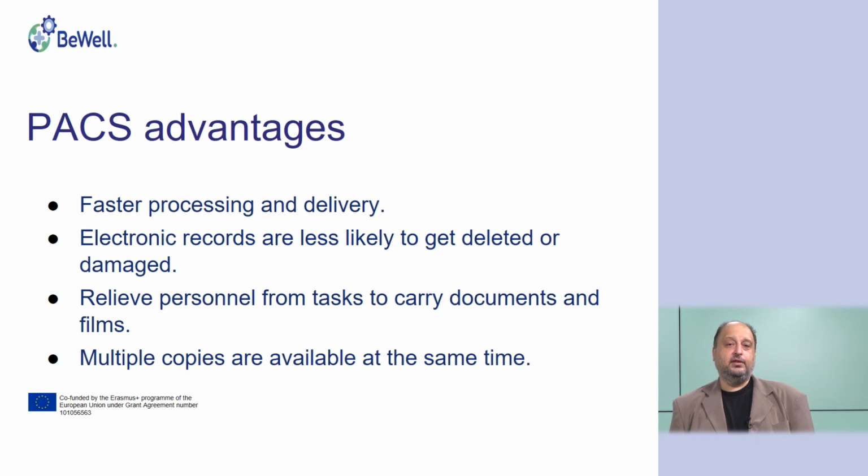Faster processing and delivery, no need for someone to take the film and bring it to the radiologist. The image is almost instantly available on the radiologist's workstation.